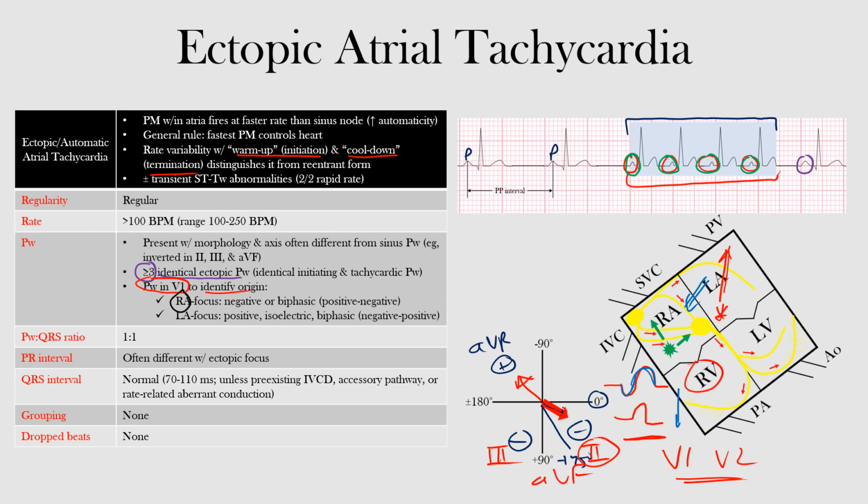So that was a little extra, but I knew you could handle it. And let's just review our chart so we don't miss anything. Okay, so we'll go through our chart here.